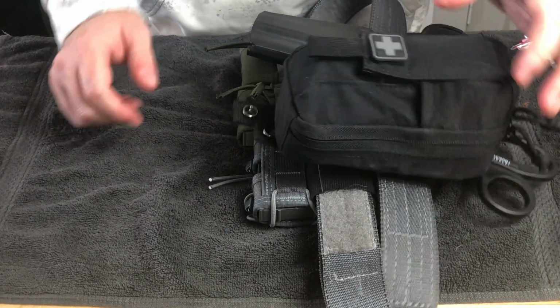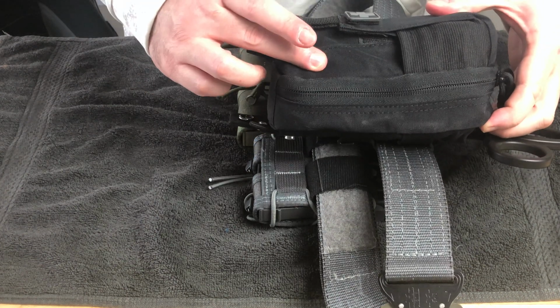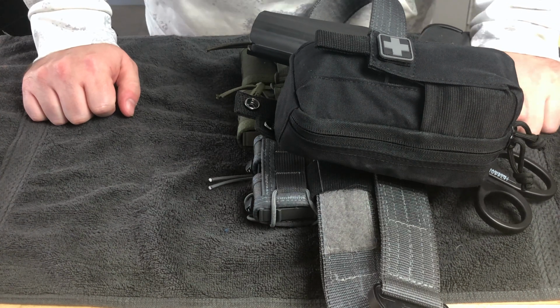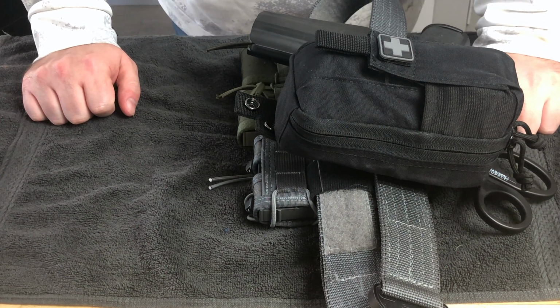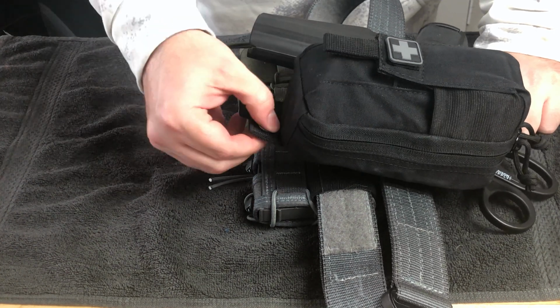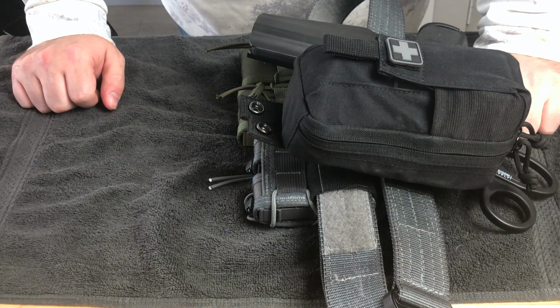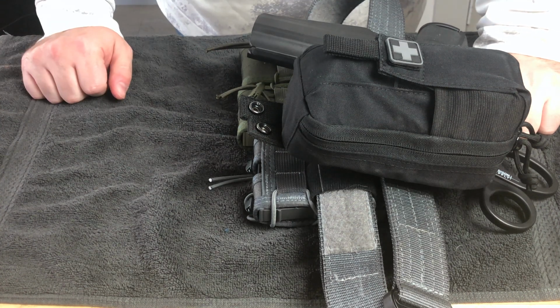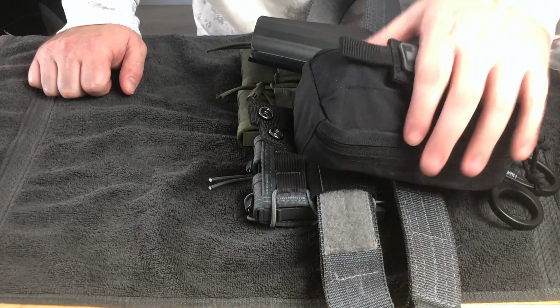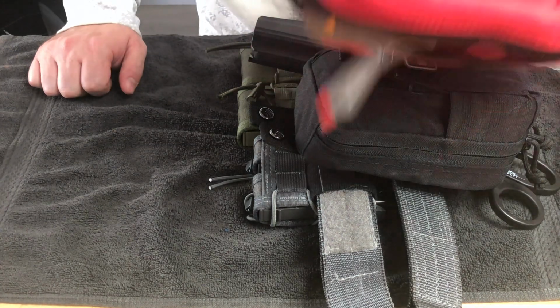You need to keep in mind, with a kit like the Roo, it's fairly thick, sticks out, because that tourniquet is on the outside. It's not to the side of it. For me, that's actually an issue. I have not been super thrilled with that. If you're seeing these, it's not held on by the straps. They're extra. It's held on by some clips. I just didn't want to cut the straps off because I may want to use them in the future. So that is my on the belt, oh shit, priority kit, as opposed to something like this guy.